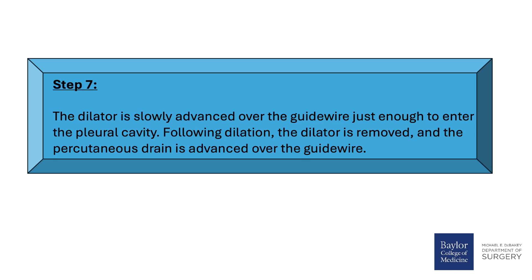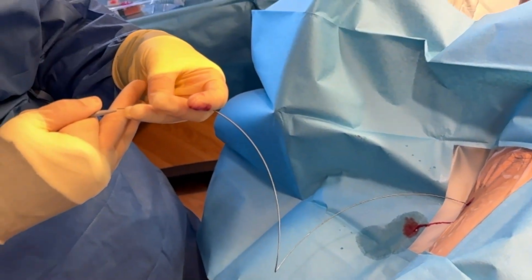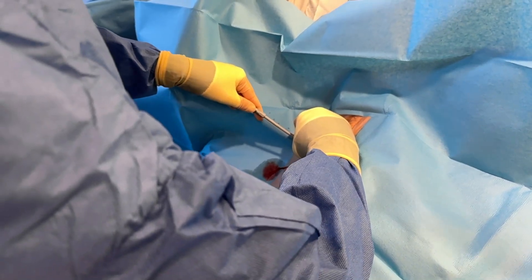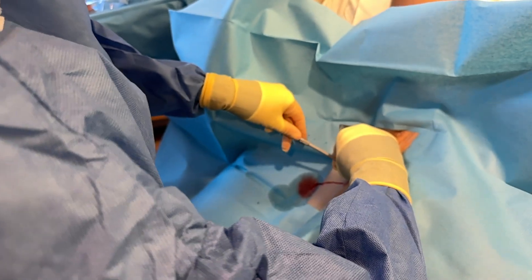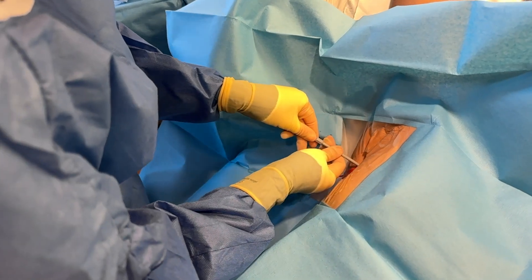Step 7: The dilator is slowly advanced over the guide wire just enough to enter the pleural cavity. Following dilation, the dilator is removed and the percutaneous drain is advanced over the guide wire. The provider narrates: 'I'm just going to make that hole a little bit wider — some pressure, but you shouldn't have sharp pain.' Instruction to assistant: 'Make sure you move your guide wire in and out.' Confirmation: 'Moving easily — spreading the pleura.'